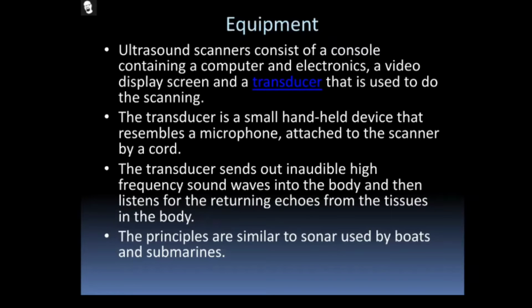But all are imaging devices. Through this transducer, we are sending sound waves. The transducer is a small handheld device responsible for producing the sound wave, and it looks like a microphone, attached to the scanner by a cord. Along with the cord, because of the power generation from the CPU, it will start producing the sound waves. Then the transducer sends out inaudible high frequency sound waves into the body and then listens for the returning echoes from the tissues in the body. That is the microphone-structured transducer.